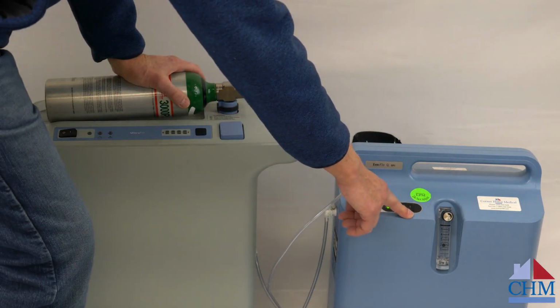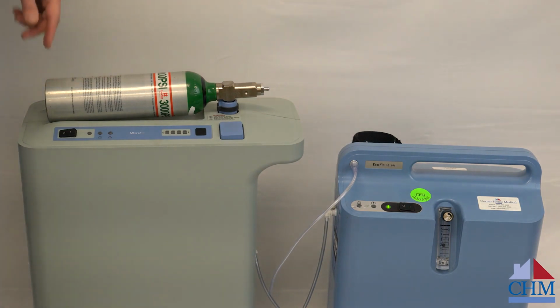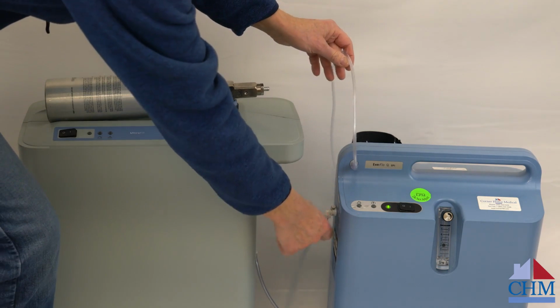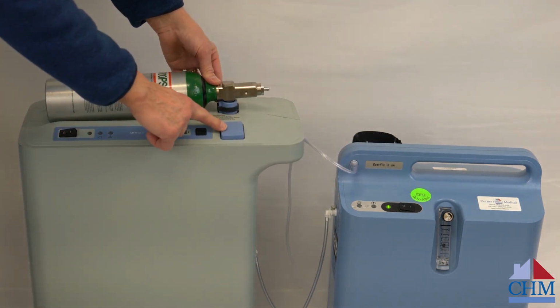So in order to fill a tank, going through the filling procedure, what we'll do, number one, make sure that this machine has been on and running for at least 5 minutes. An oxygen concentrator, because of the way it works, starts out putting out a low percentage of oxygen, and after several minutes it'll put out its optimum amount. So you want to wait at least 5 minutes and let the machine run. Once it's been on and running for that amount of time, you want to make sure that these tubings are connected between the two.